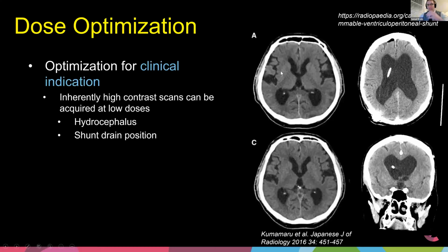And so setting up an idea of when to CT scan is probably, as I've already said once, I'll say it again, one of the best ways to, quote unquote, reduce radiation dose to kids, but even adults. And so setting up that level, that's maybe higher than the dose optimization team. That might be something where you need to really bring in the leadership of radiology, and maybe other groups like pediatrics or surgery, the emergency room. They may be able to come together and help decide when we order and when we don't order.